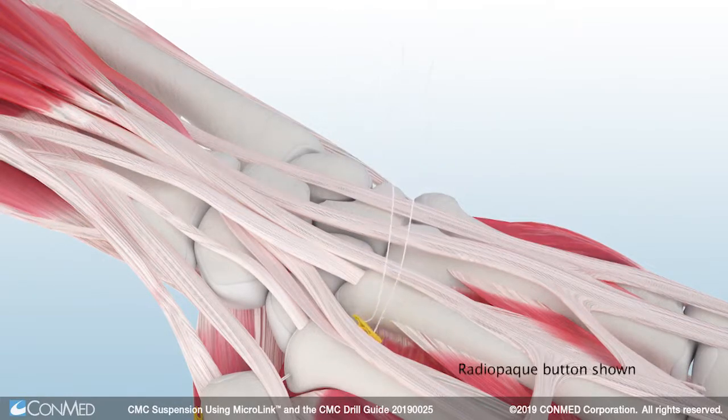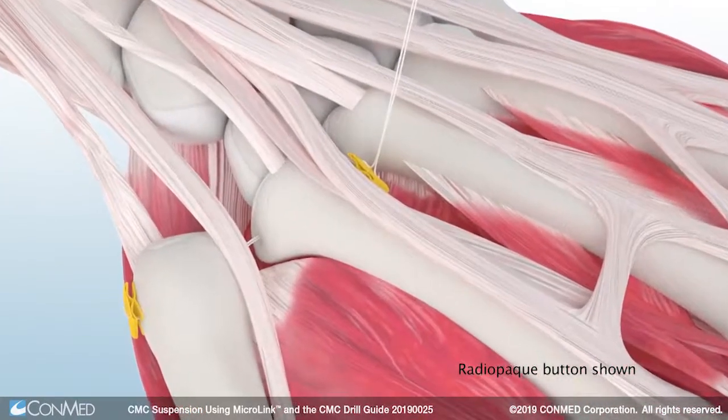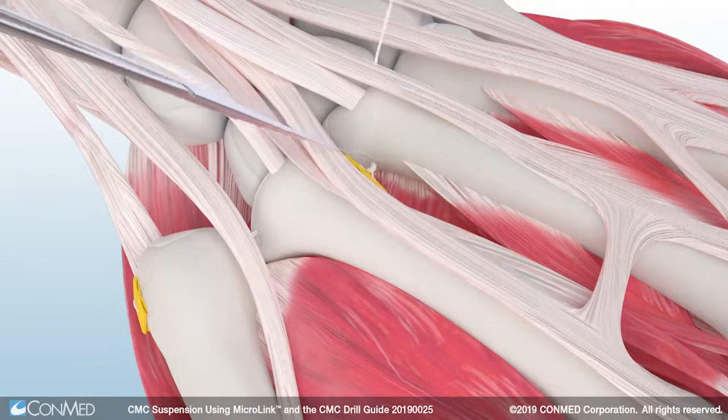The Radiopaque Microlink all-suture button allows for visualization of repair under fluoroscopy. A minimum of five knots is required to ensure fixation. Suture tails are then cut and the repair is complete.